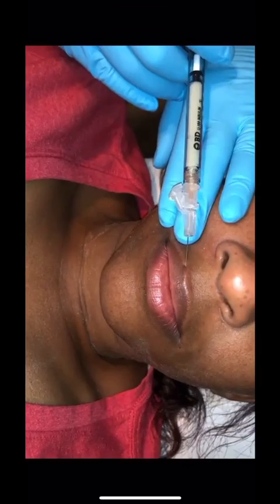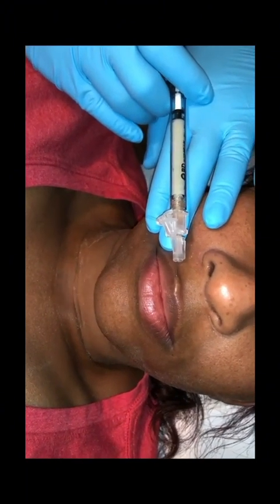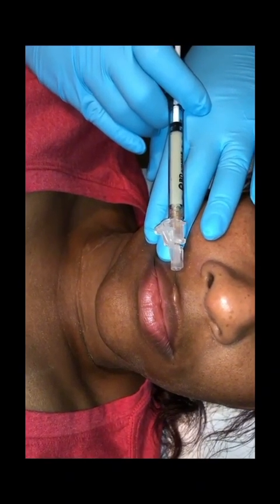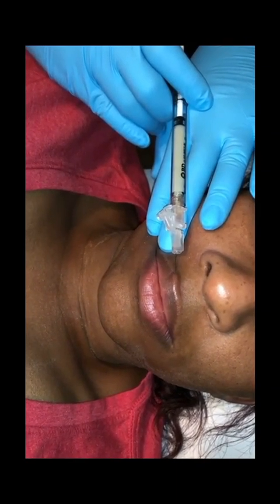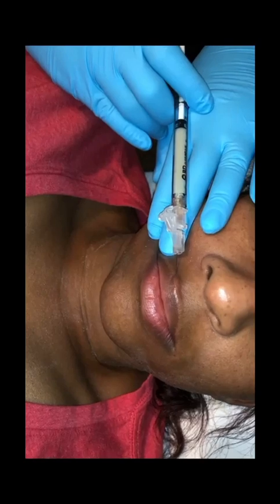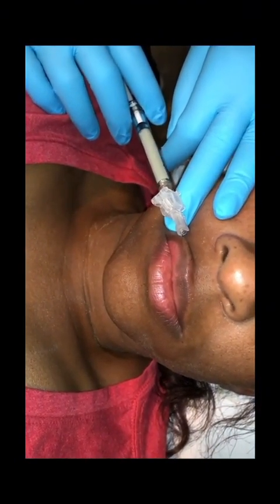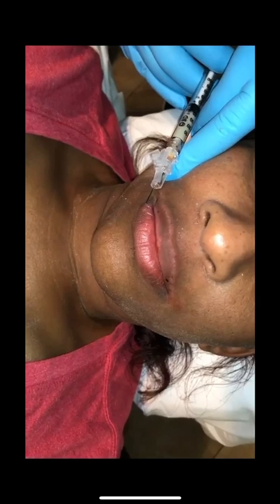I'm also able to use Juventix biofiller. Their biofiller machine helps create lip fillers — did you know you can get lip fillers from plasma? The biofiller machine creates filler thickness to perform the lip filler procedure. Here I'm injecting the client's platelet-rich plasma along the vermilion border of her lip, then in the upper body of the lip to contour and give more volume, and also in the lower lip to enhance volume and give her full lip fullness as she requested. The syringe and needle are also provided by Juventix.